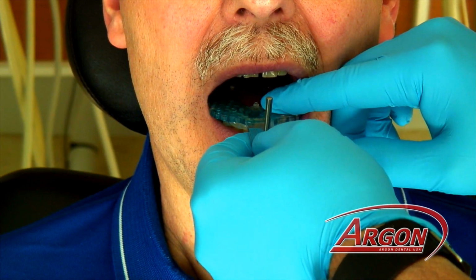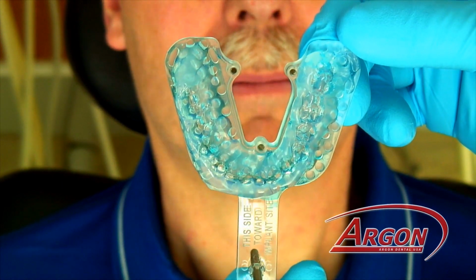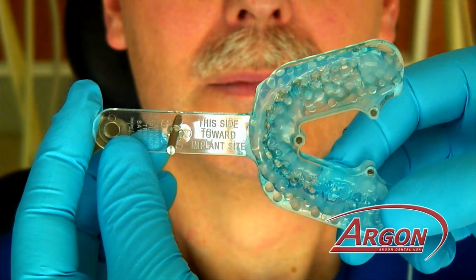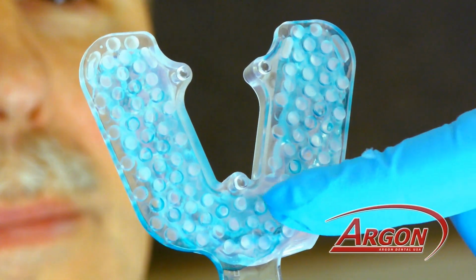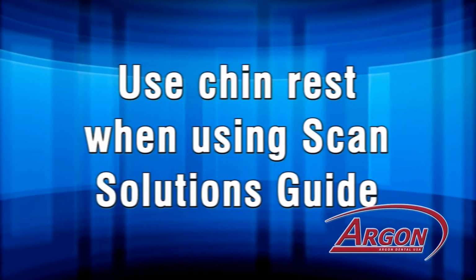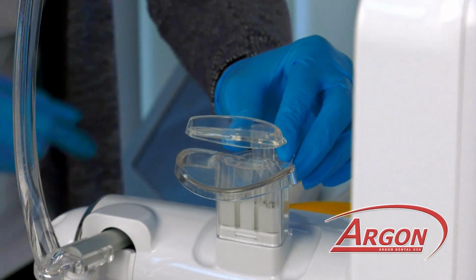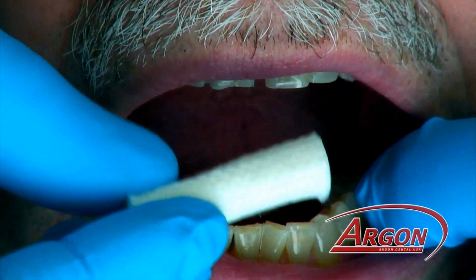As you can see, the bite registration has been adhered using tray adhesive. And on the scan solutions guide, it says this side toward the implant site. That was on the mandibular arch facing down. The three titanium pins, as you see, are what we use to merge into the CT scan. When using the scan solutions guide, you would eliminate the bite stick and only utilize the chin rest. We still recommend placing cotton rolls to separate tissue.